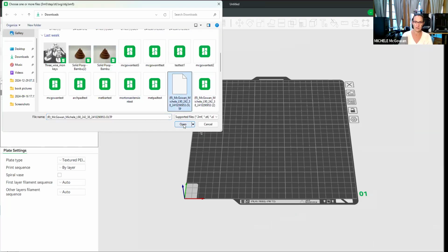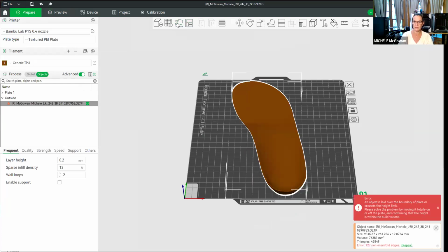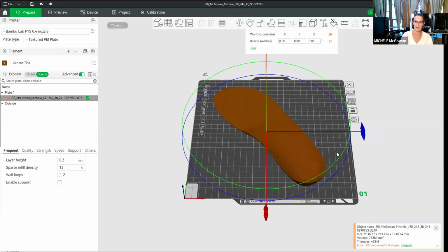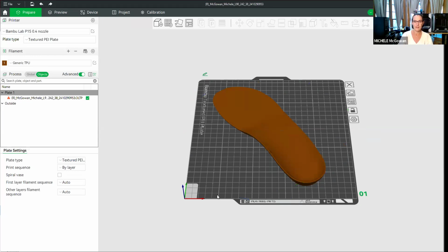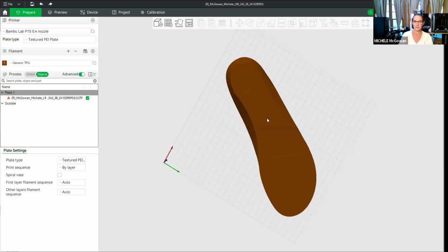This is my orthotic. It is going to pop up on the build plate. Once it's on the build plate, they have this nice auto orient, so it flips it onto the correct side. I then want to rotate it in the Z axis so I can have it nice and flat and fitting perfectly on the actual build plate. Once I've done that, I'm going to flip the build plate over and click on the device.